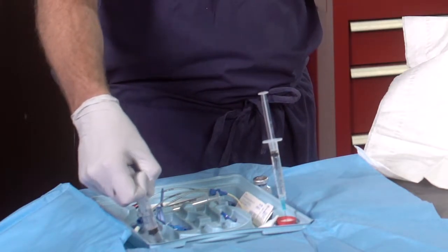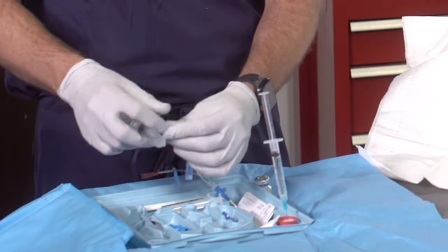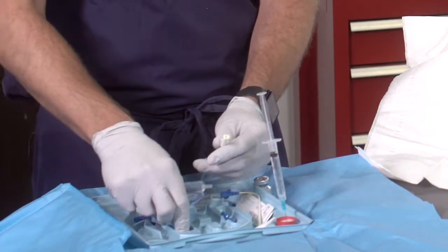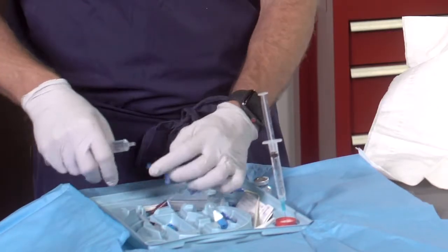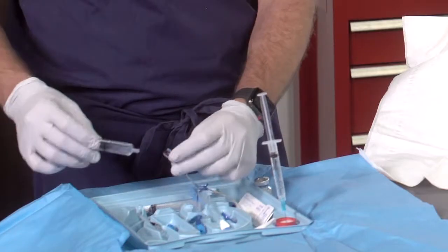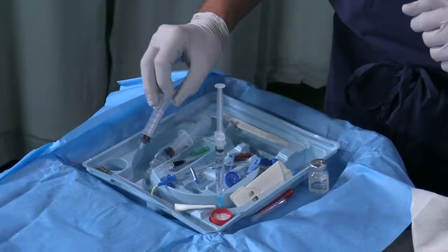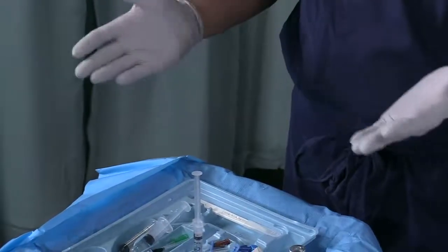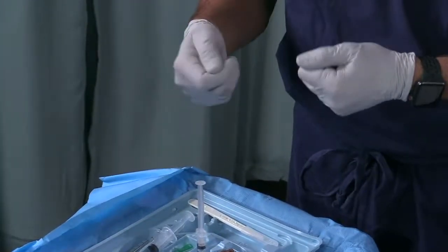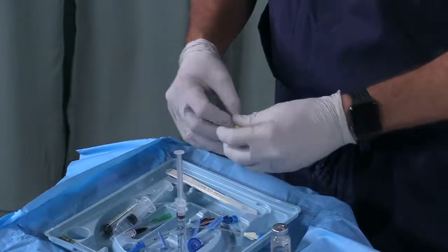Each one of these lines needs to be flushed with sterile normal saline and then capped, except for the distal port where your guide wire is going to come out. Have someone pour the normal saline into the reservoir on your sterile field. Flush each one of the lines, make sure they're clear, and cap them as you flush. For the distal brown port, flush it but do not cap it because your guide wire needs to come out there. Once you have your triple lumen flushed, go over the rest of the things in the kit — there's a scalpel to nick the skin, and a suture and clip to secure the triple lumen to the skin.